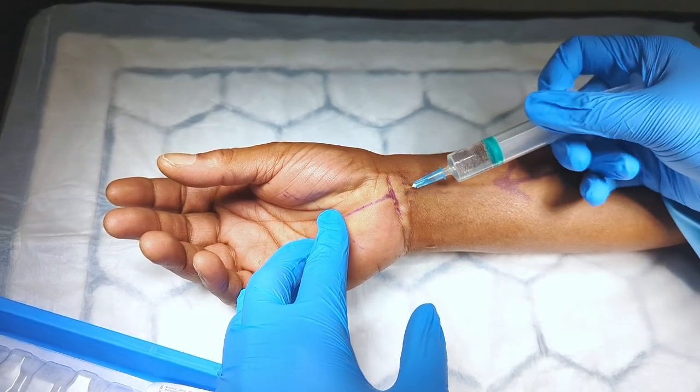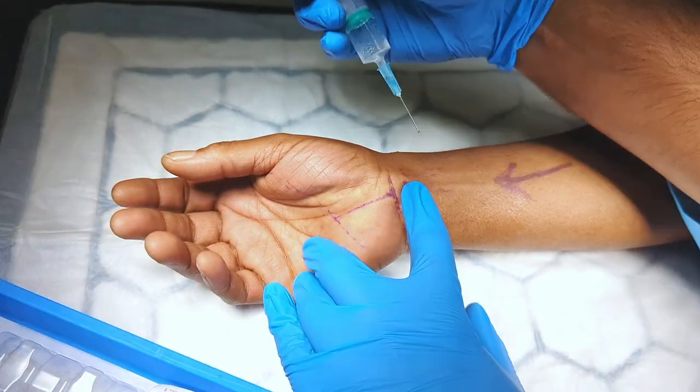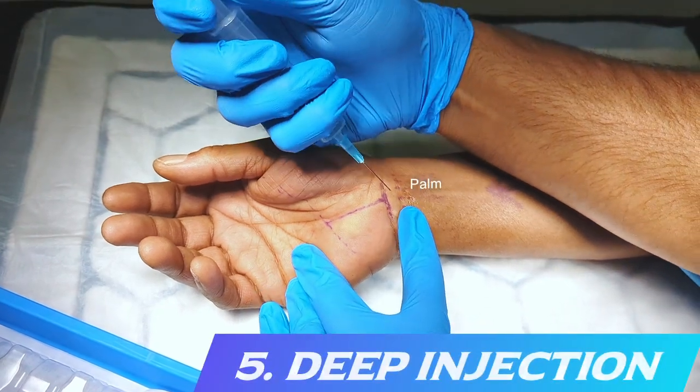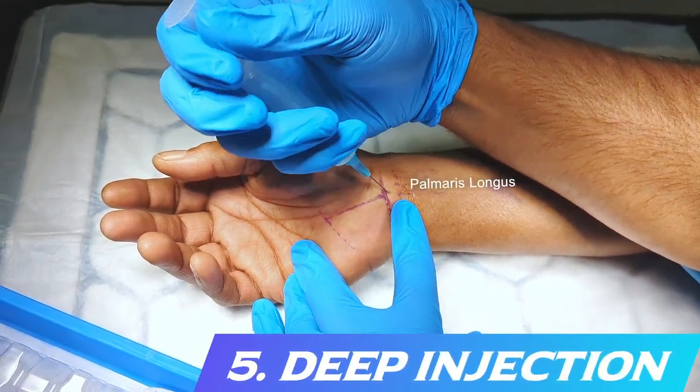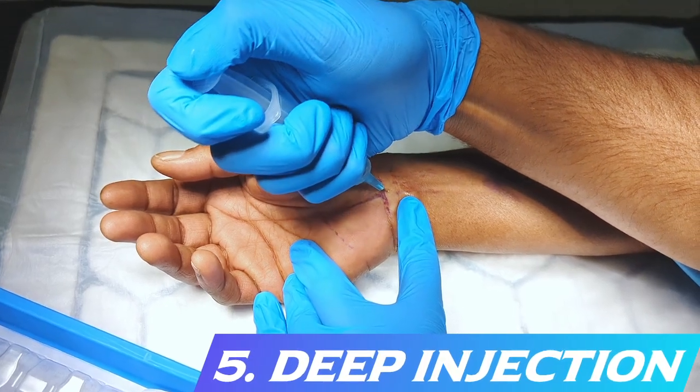The needle is then withdrawn and, through the already anaesthetised area, directed ulnar and deep to the palmaris longus to infiltrate the area around the antebrachial fascia, to ensure the patient is comfortable when performing the proximal release.